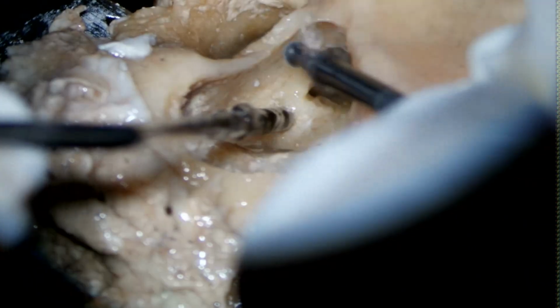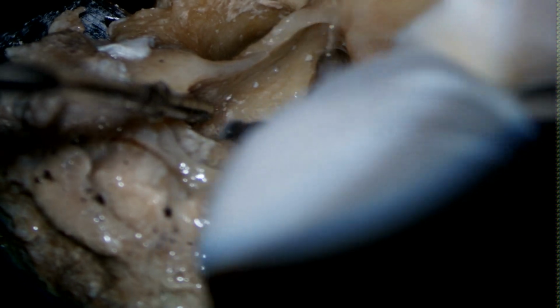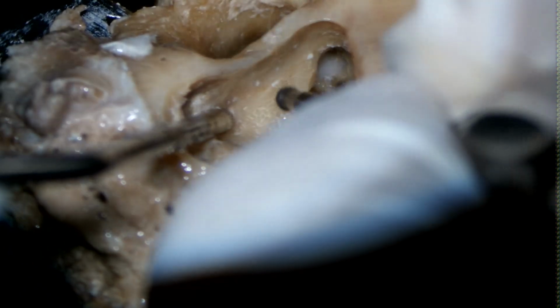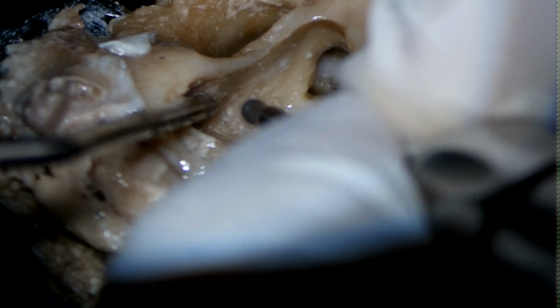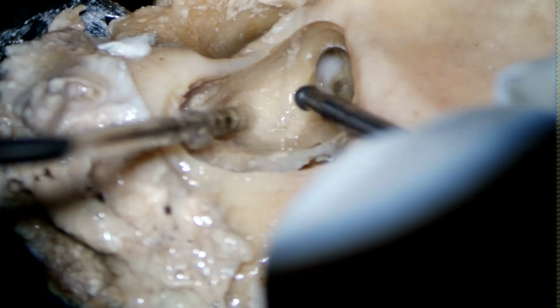So you need to see the chordofacial angle in cases of cochlear implant. Now I need to drill more. So if the chordofacial angle is very small, less than 25, you might have difficulty.